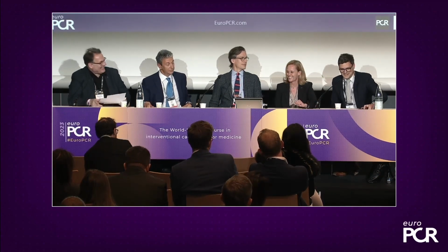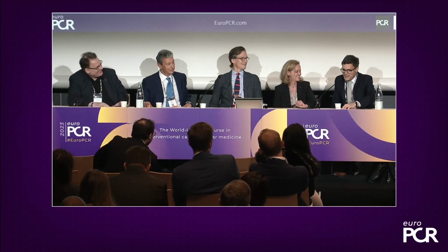Yeah, it depends. No, I think the driver for me actually to introduce ICE is some kind of frustration when you are in a very challenging situation, doing edge-to-edge or doing Cardioband, and you just don't have sufficient quality at some point of the procedure. It could be variable. It can come during the procedure, and you cannot finish the procedure in some way. So that was really the driver.